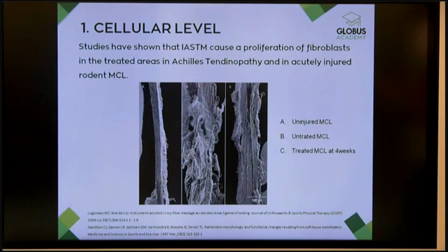By using the tools, we are promoting, as we said before and also in the webinar before, fibroblast production, the fibroblast stimuli, so we can achieve elastin, hyaluronic acid, growth factors, all those substances that are very important for the healing of the tendon.